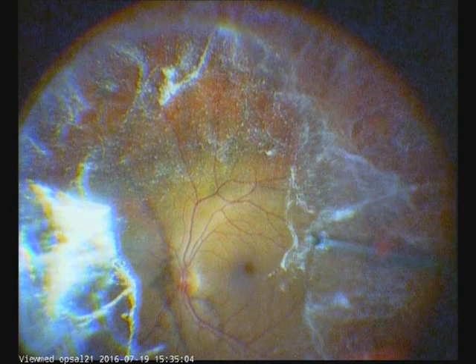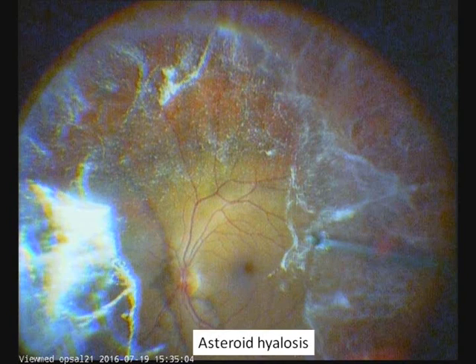Well, this is an interesting fundus finding during vitrectomy. What is your diagnosis? This is an asteroid hyalosis. Asteroid hyalosis, which disturbs the patient.